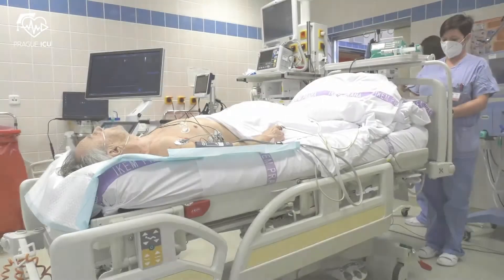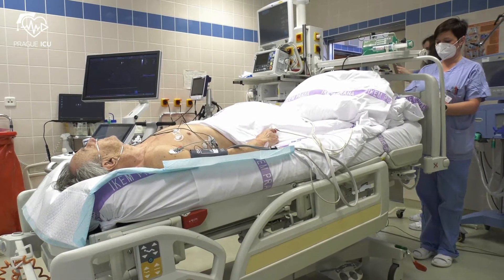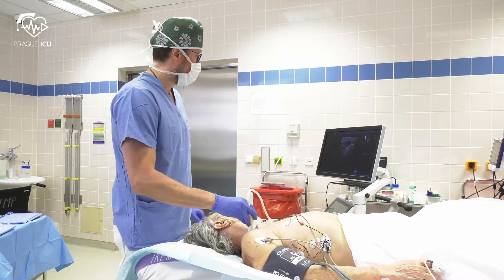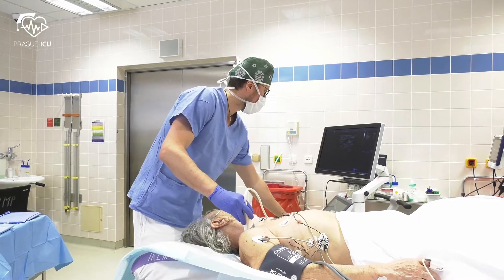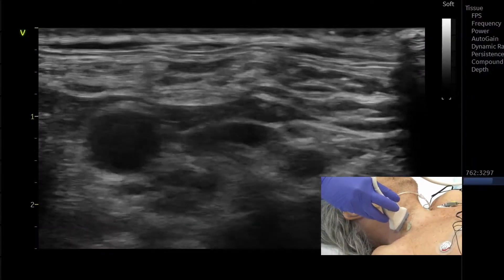Before CVC insertion, place the bed in mild Trendelenburg position that will decrease the risk of air embolism and ensures maximum venous filling. Before scrubbing up, perform a provisional ultrasound to check vein patency and exclude thrombosis.